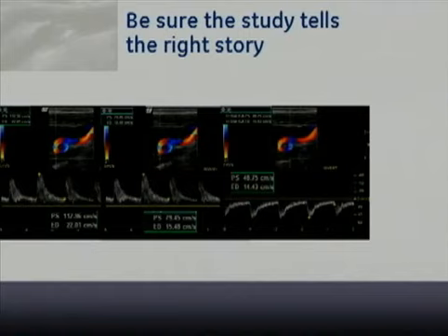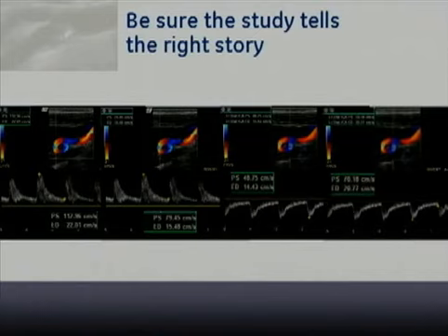Now, as I came around the coil, continuing to sample, all of a sudden I get a velocity that's 48 centimeters per second. Again, this makes absolutely no sense. It's an angle correction error. Even though the image looks like the angle correction is accurate, it's not. You update the image, double check the location of your sample volume, and angle correct to the walls as it curves around. It's challenging to do, but making sure that the velocity values make sense.